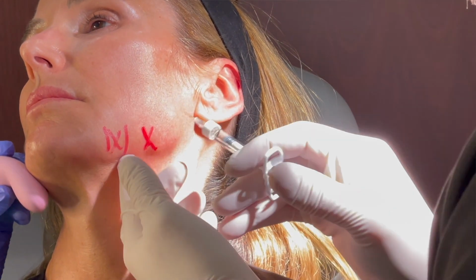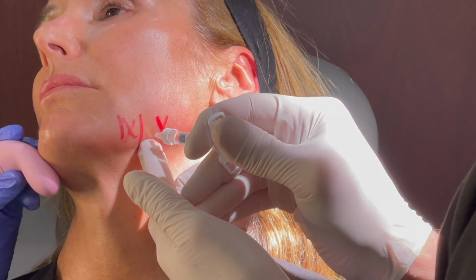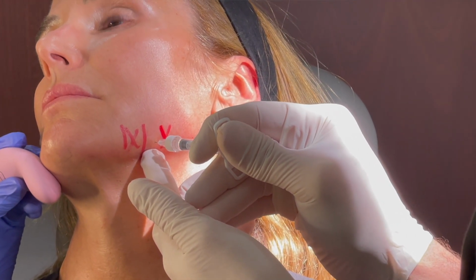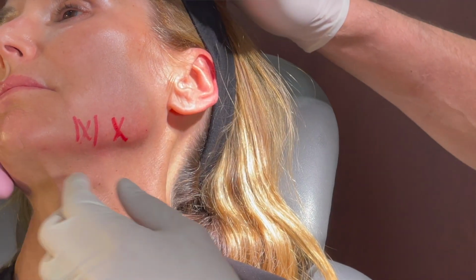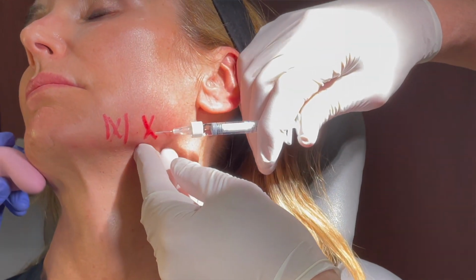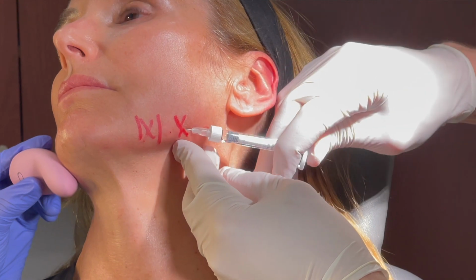And now I'm going to go anterior to the antegonial notch along the border again, down to the periosteum, and inject another 0.1. And now in the area of the antegonial notch, where the vasculature is, I'm going to do it in a subcutaneous plane. You want to be superficial, so I'm going to use a fanning pattern, constantly moving.